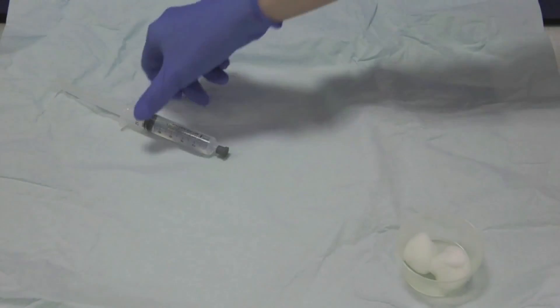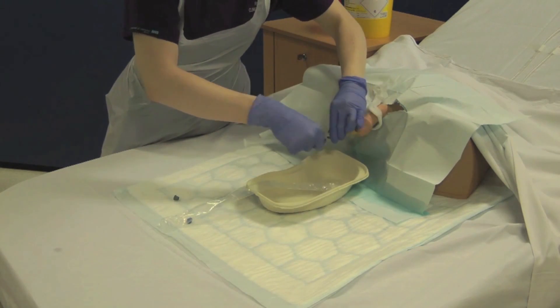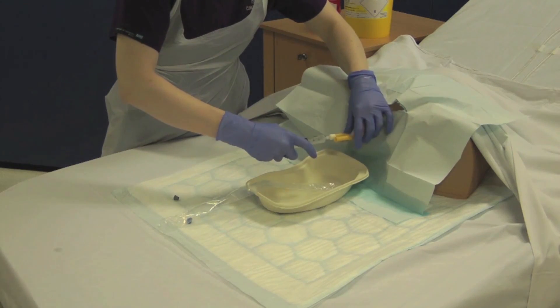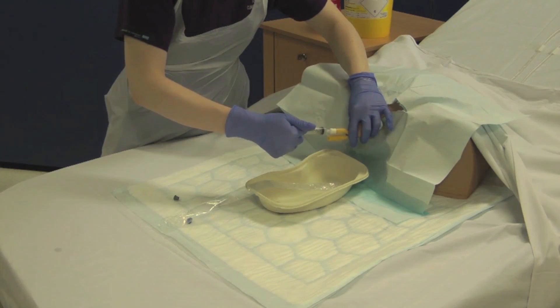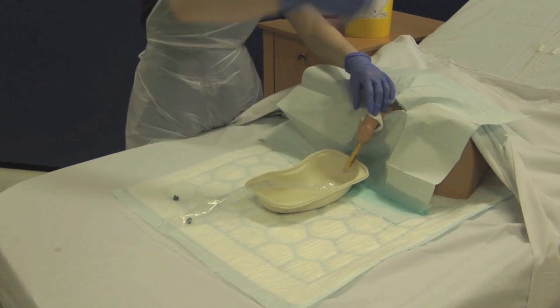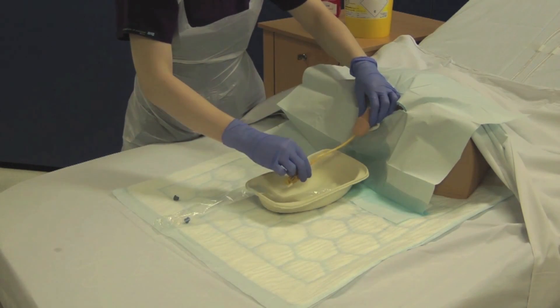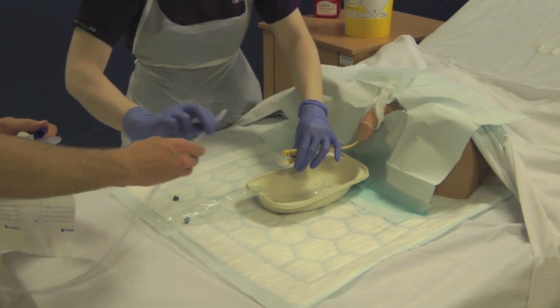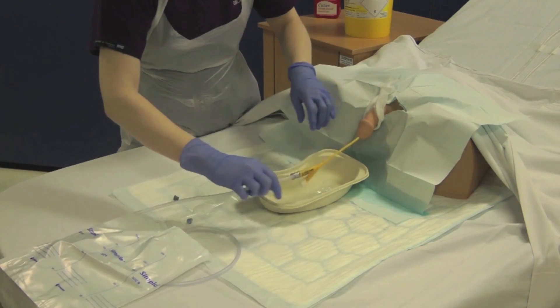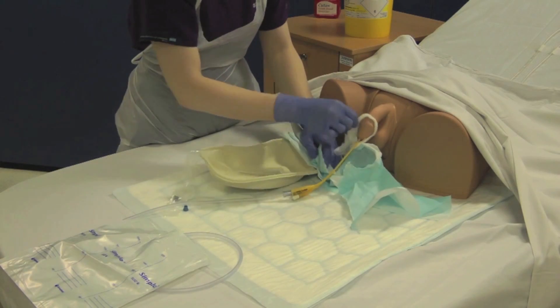Take your 10ml of sterile water from your sterile field and inflate the balloon, observing the patient for any signs of discomfort. Dispose of the syringe into the sharps bin. Once the balloon is inflated, withdraw the catheter gently to ensure it is secure against the bladder neck. Connect the selected drainage bag, which can then be attached to the patient's leg or catheter stand.